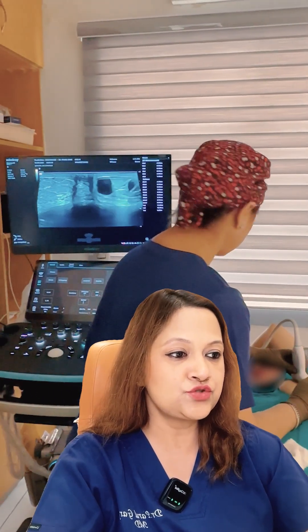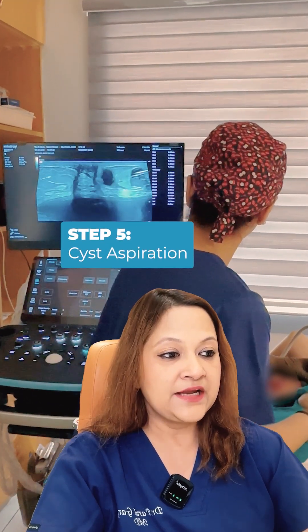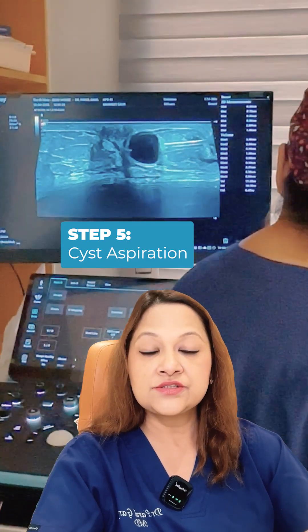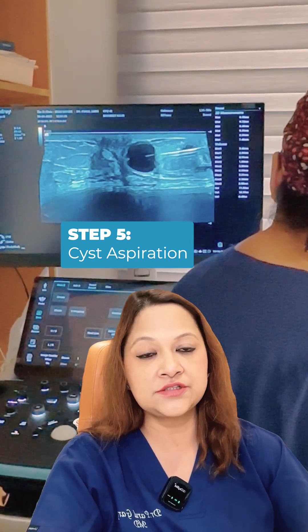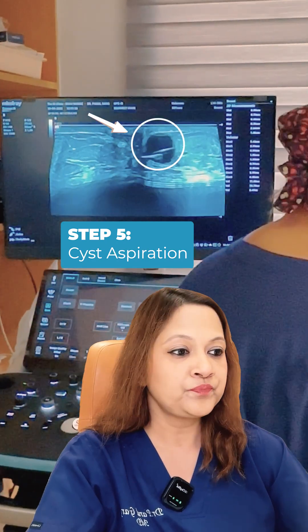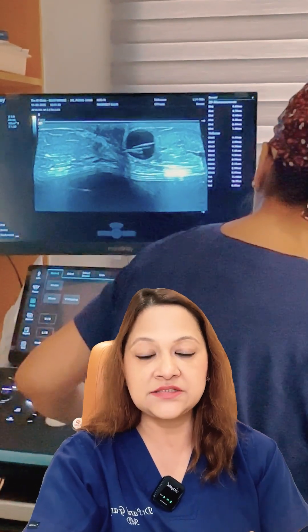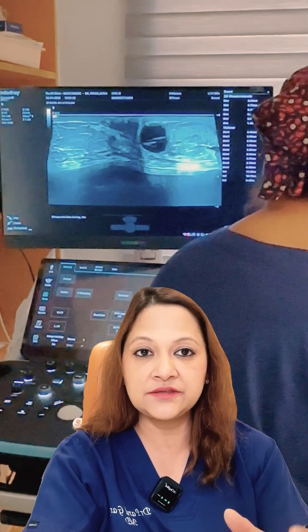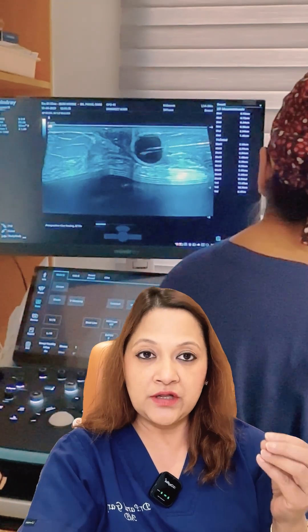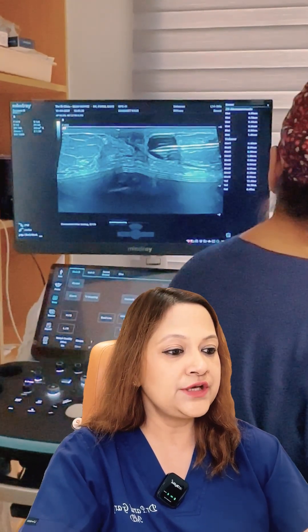We have now inserted the aspiration needle, which you can see on the screen as the bright longer structure. The black rounded structure is the cyst from which we are going to aspirate the fluid. Any cyst will appear black on ultrasound because water and fluid appear black.